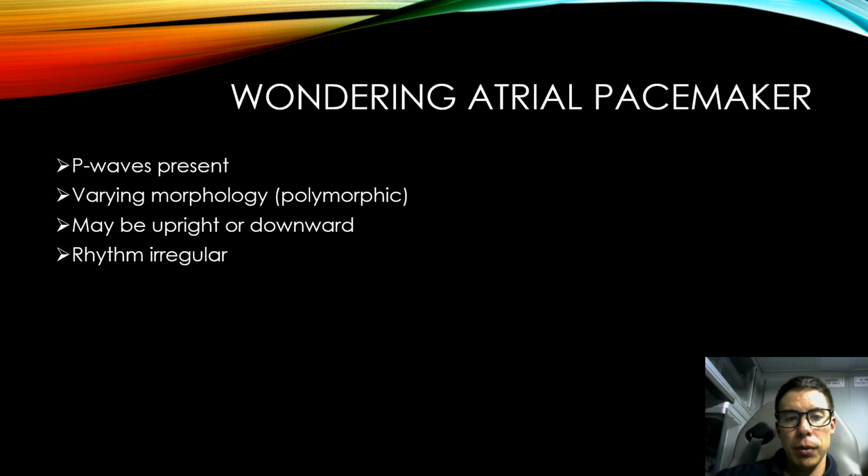So we're going to talk about that a little bit in the next slide, when we go over the physiology of wandering atrial pacemaker.